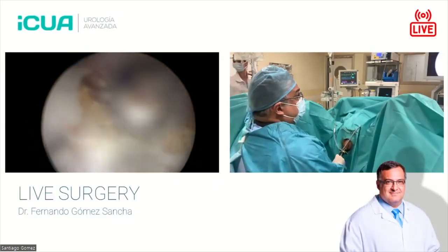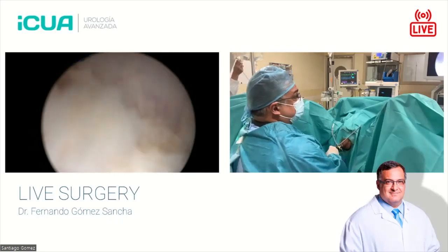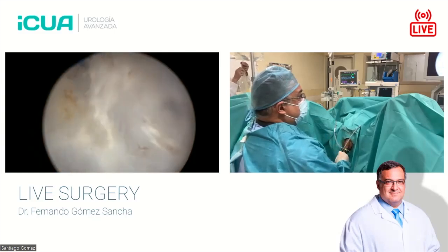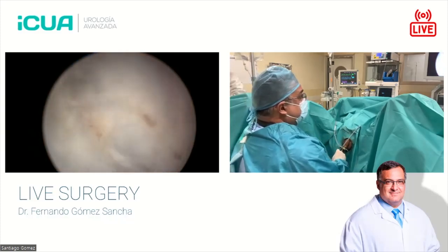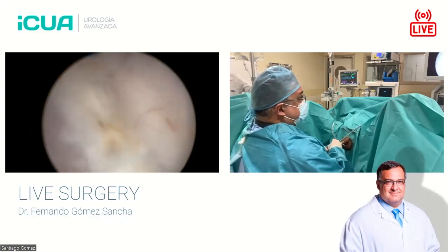Fernando, I was climbing towards 12 o'clock. Yes. Let's discuss the instruments. I don't know if you have mentioned in the first part of your presentation the tip of the instrument. Is it important to follow the plane correctly, or are all instruments good, or are some better? What's your opinion?